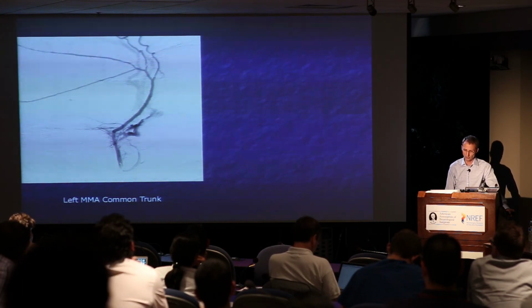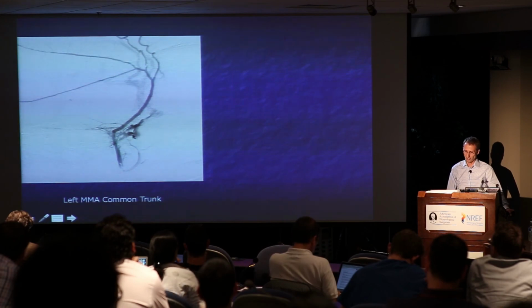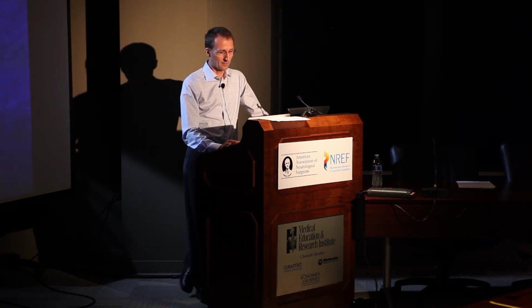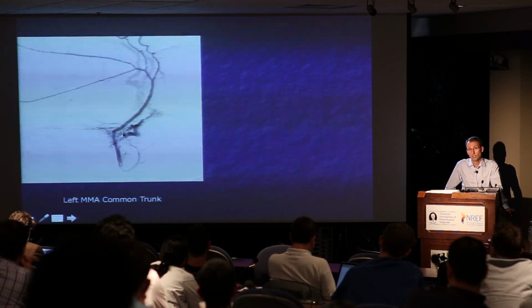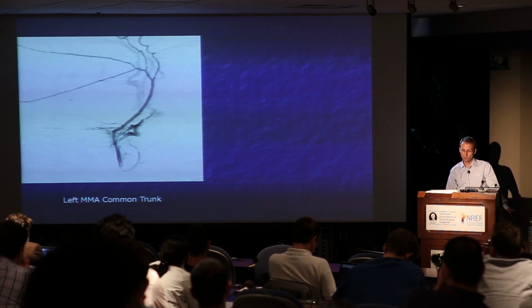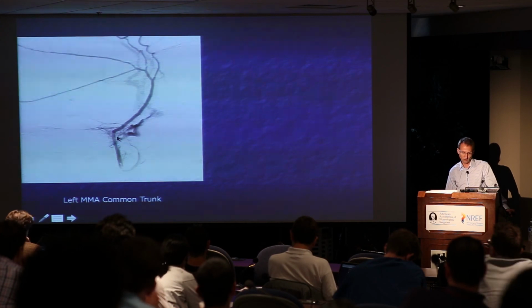And this is just a lateral projection. Again, you can see that the fistula actually is located here. This is sort of the venous pouch. Hopefully you can recognize now the cortical venous outflow. But again, this is the area, that thing right there, of the petrous branch of the MMA that we know is going to be supplying the facial nerve. And so I'm not actually super excited about the notion of embolizing this fistula from this location.